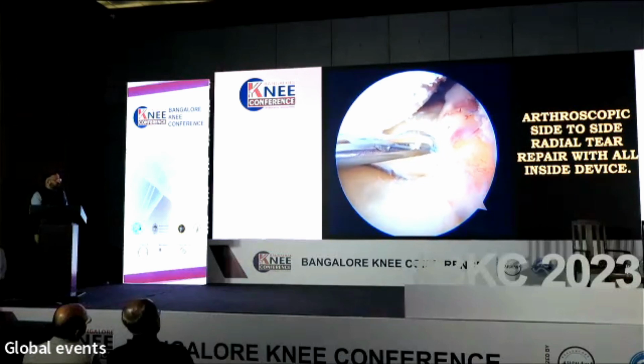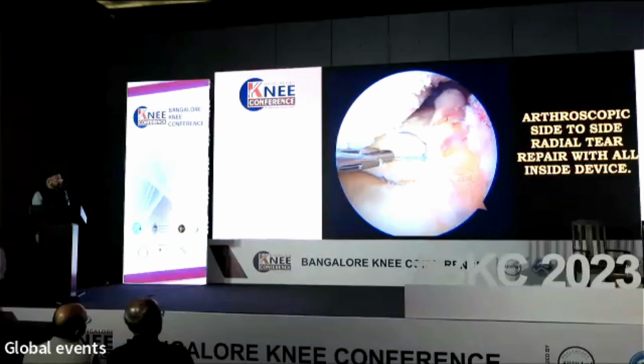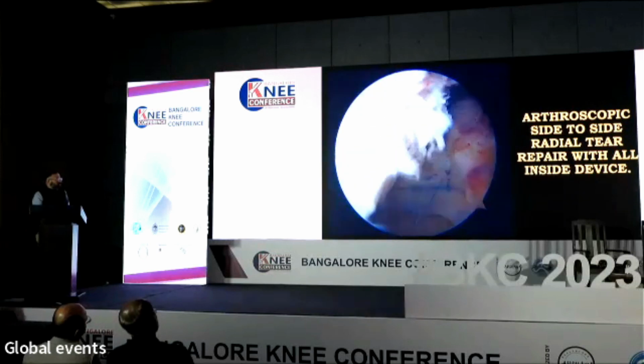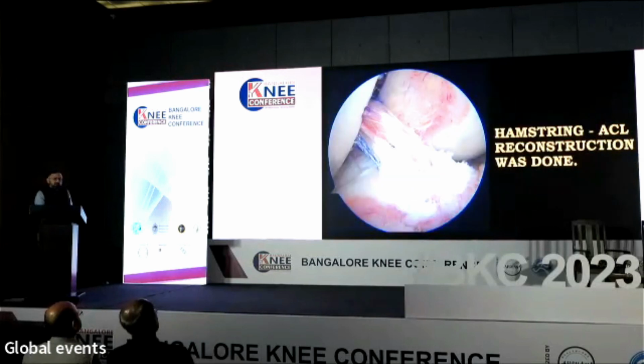Knee scorpions make your life easier at times when you want to reduce the cost of these all inside devices. This patient also had an ACL injury, so it went on to a hamstring ACL graft.